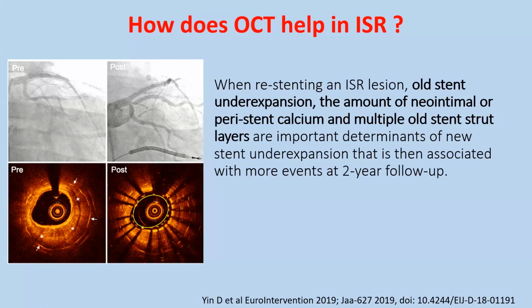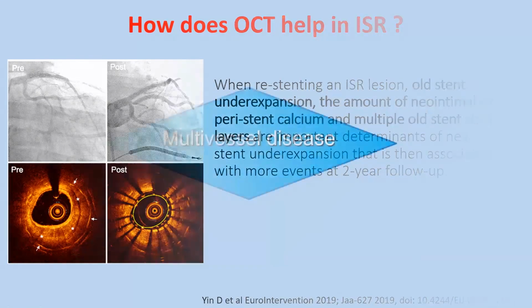If there are multiple stents, again we should know that it's important to understand to properly dilate it rather than putting additional layers of stent and giving a final good MLAs and good expansion of the stent.